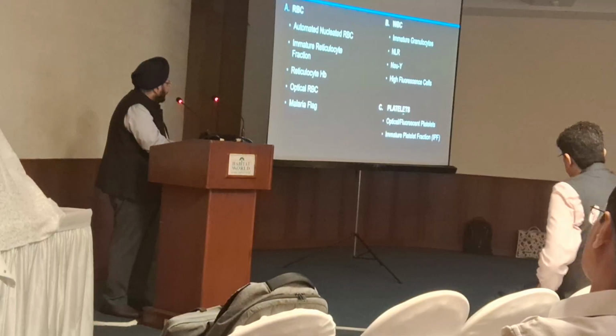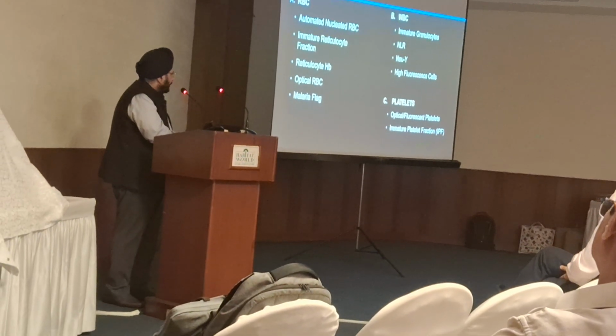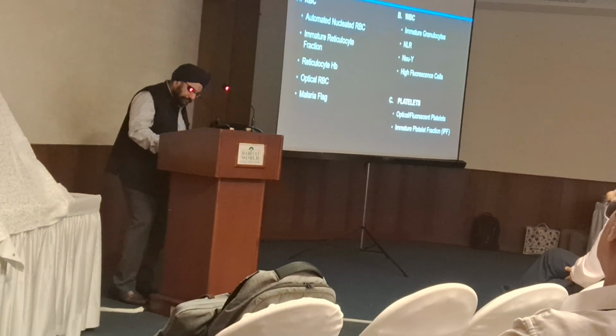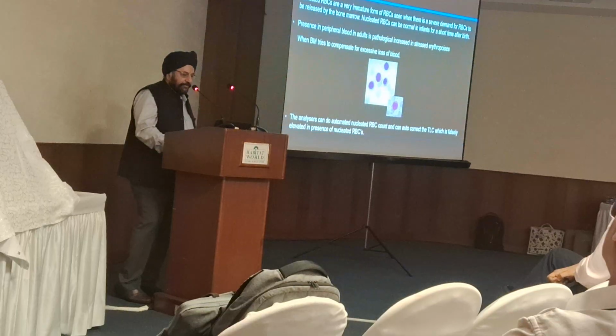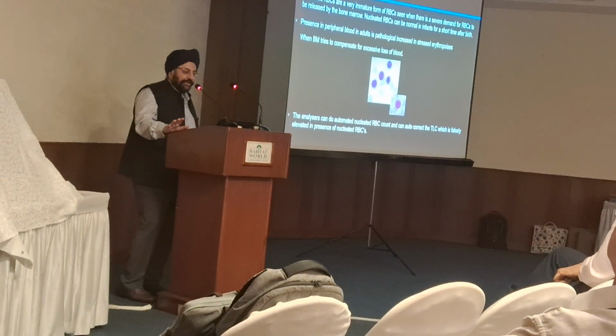In the platelet, we will be discussing optical stroke fluorescent platelets, and this parameter we all now know is immature platelet fraction. So coming to the RBC parameters. First, most modern analyzers can now calculate nucleated RBCs.